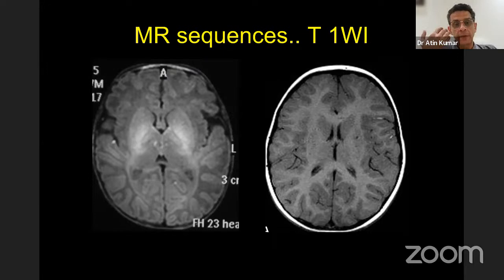And once we give additional radio frequency pulses, they malalign. And when we remove the pulses, they come back to their energy state. Once they release the energy, there are electronic algorithms to check those energy states and convert them into gray and white images, which we can see and interpret.